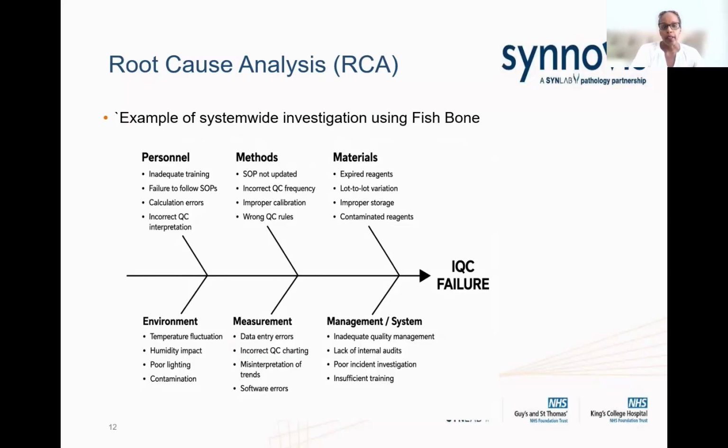Are the wrong rules applied? So when you're doing, for example, reagent acceptance, sometimes you're using calculations yourselves in which you're setting your acceptable values, perhaps closer to your mean, on the data you collected yourself, which are not based on the manufacturer. So you need to make sure that is correct when you apply it to your instrument.